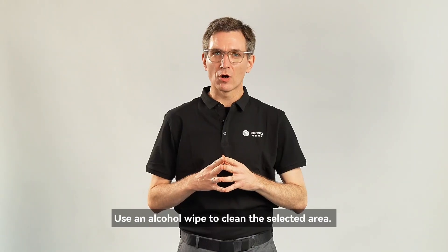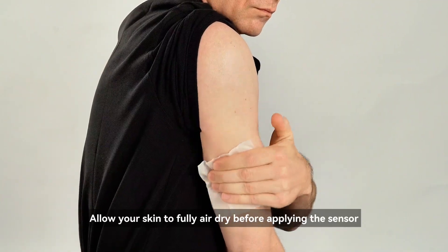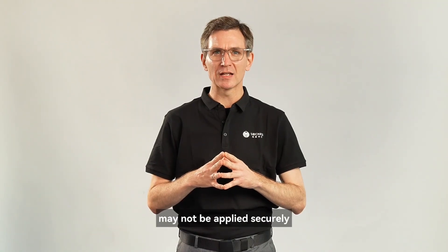Use an alcohol wipe to clean the selected area. Allow your skin to fully air dry before applying the sensor. Otherwise, the adhesive on the back of the sensor may not be applied securely.